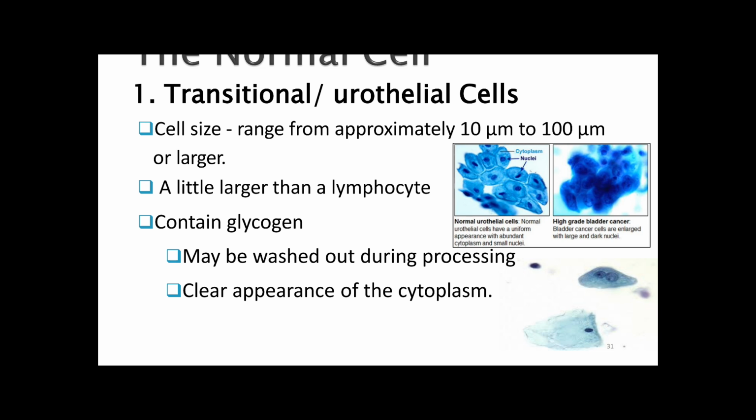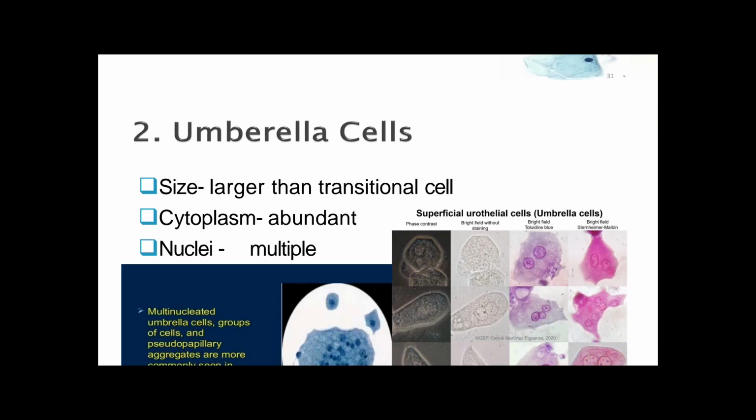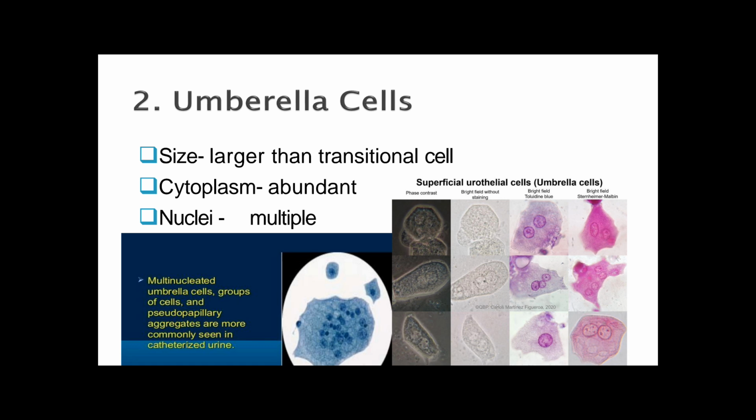So the cytoplasm volume is smaller in cancer cases, and the nucleus is the larger one.